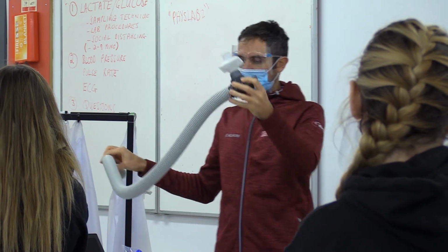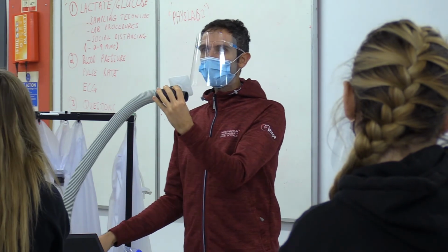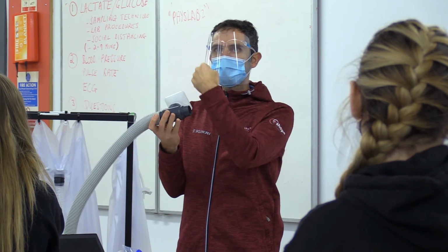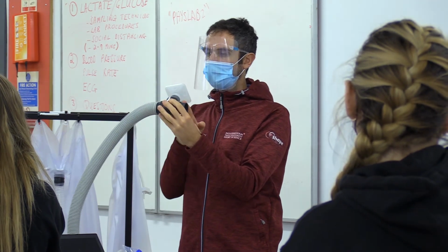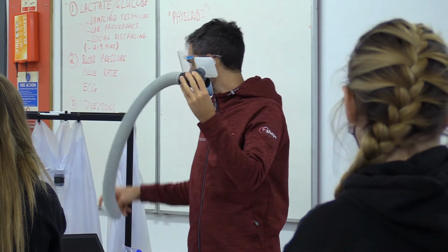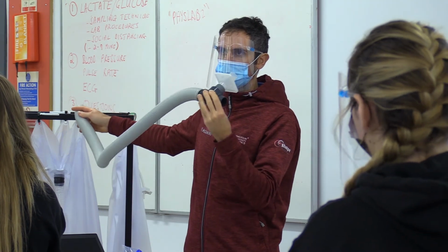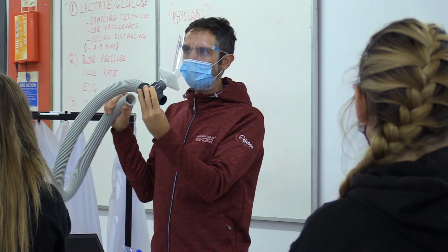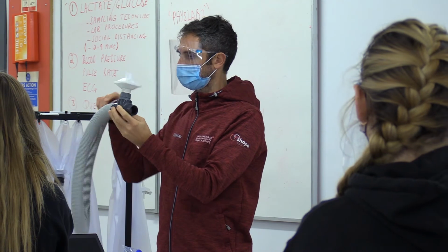Okay? Then that's all connected. When you're breathing, you will breathe in from the lab. It will come into the T-valve, obviously into your mouth. When you breathe out, that side will close and the air will go eventually into the bag. Okay? So your participant will wear this mask throughout the 12 minutes of the exercise test.